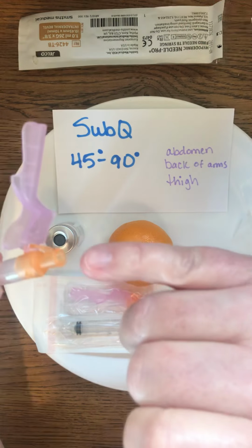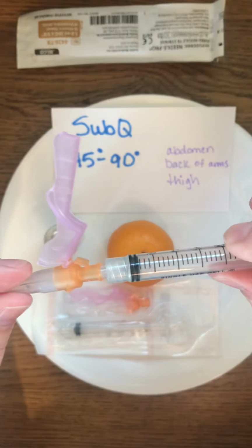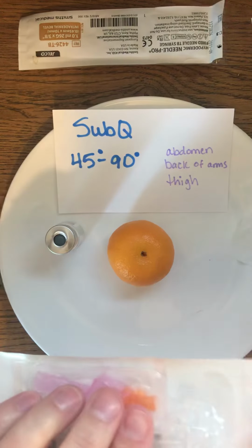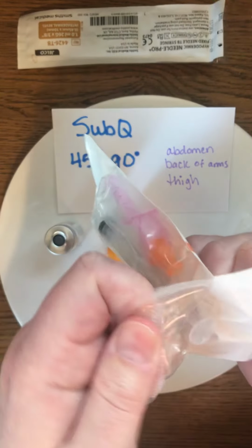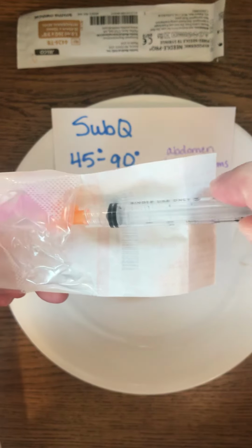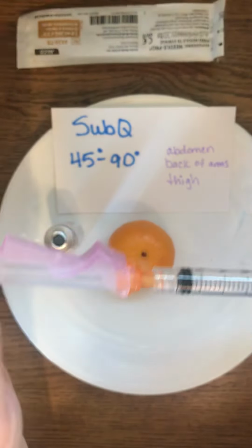But again, because both this area here and this area here are considered sterile, we don't want to touch those areas because we don't want our person to get an infection. So when we open up our package, it's like this. So I'm going to open up like this, and I'm going to fold it down. And you can see here, everything is still in the package. I'm going to take this out, and right away, I'm going to put it in here and twist it on. And now I can take the whole thing out of the package.